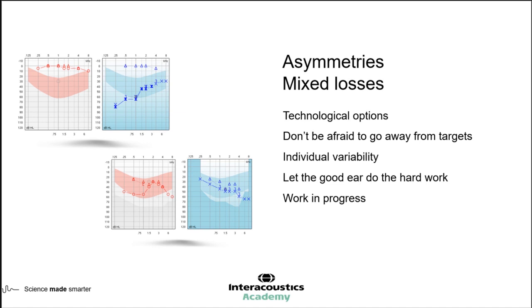And I think it's important that you remember what the patient is looking for. Do they want a sensation of sound? Do they want clear audibility? Are they not too bothered about audibility, but they want to feel balanced? There are reports in the literature of cases where people feel insecure without having a hearing aid on each ear, or feel insecure without having a hearing aid on a completely dead ear, but they just want some kind of sensation of balance. And if you've done your preparation earlier on at the assessment stage, hopefully you'll know what that particular person's motivations and desires and wishes are, so that you can do the work with them. And again, sharing the experience is really important to get towards the outcome that they desire.